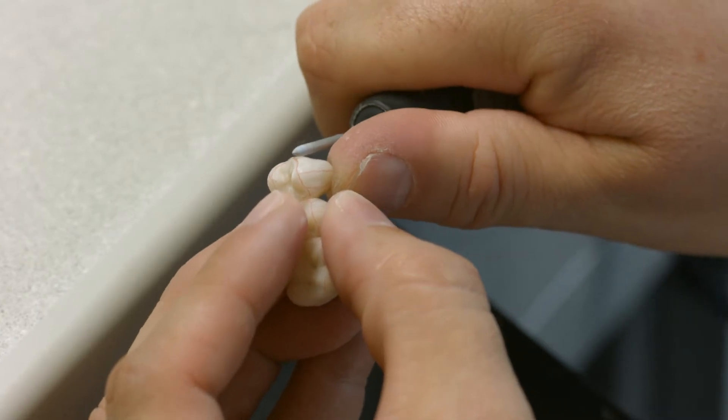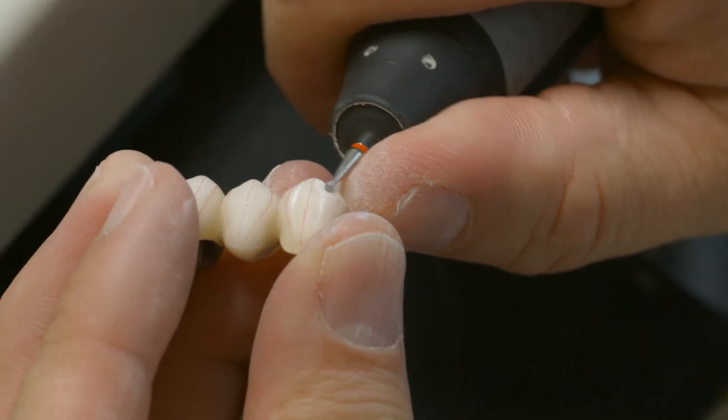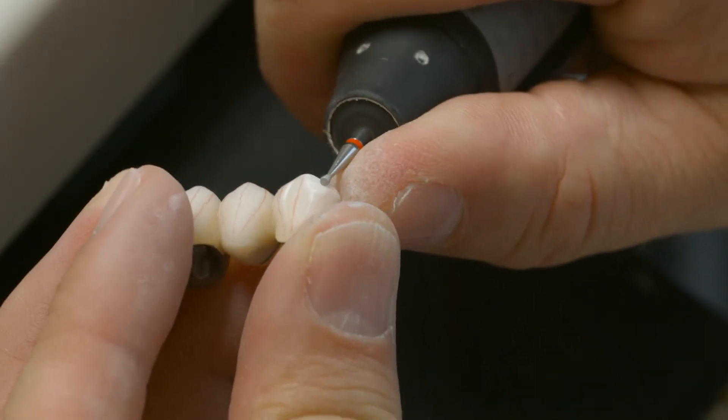Use diamond burs to give the restoration a true-to-nature shape and surface texture and faithfully reproduce growth lines and convex and concave areas.